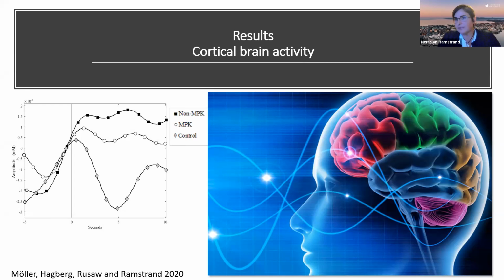So what this suggests to me is that when we are in a clinical environment observing someone walk, and what we look at is temporospatial data, we look at timing, and I'm not going to suggest that we looked at this in great detail, but what it suggests is that where we don't see differences, and certainly where we don't measure differences in temporospatial data, there are significant differences in cortical brain activity. So the attentional demand is greater without the microprocessor controlled knee. And I think that's really interesting.